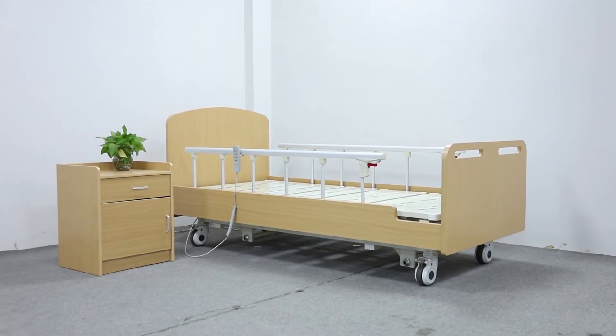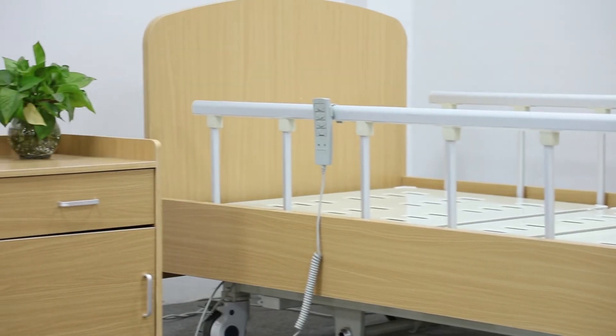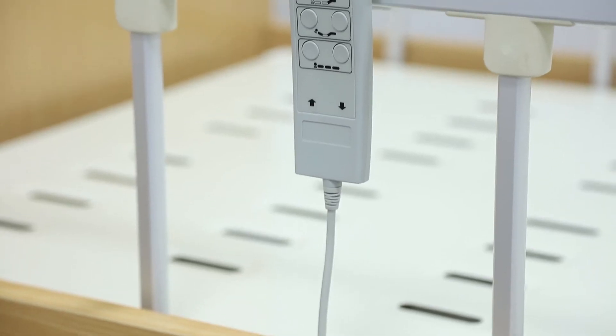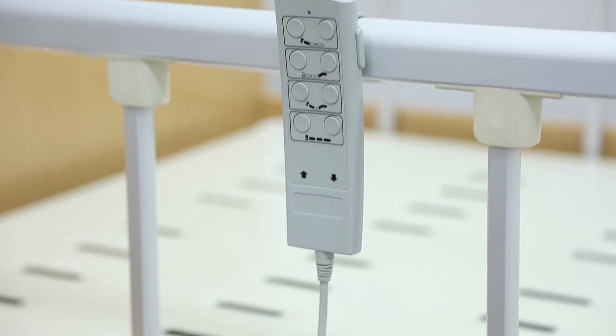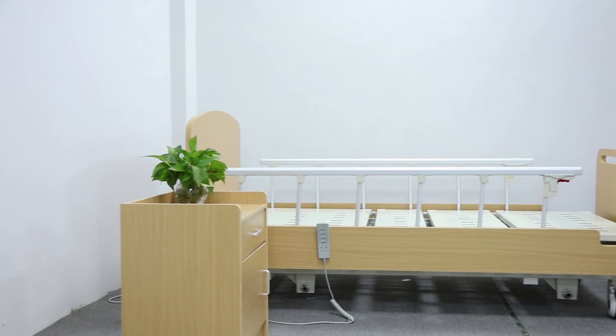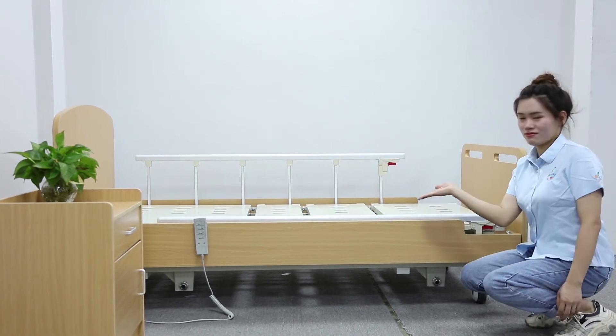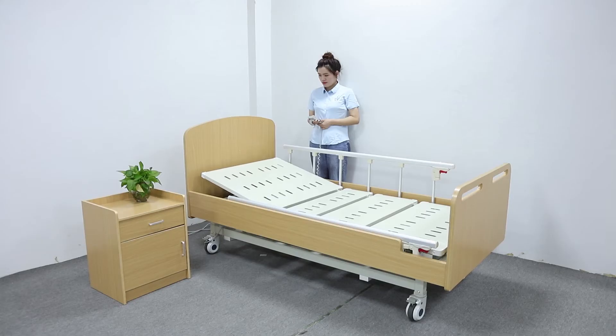Three-function home care beds. These beds are extremely cost-effective, especially in comparison to the average cost of a full electric bed. Interchangeable end boards offer more versatility for each user's needs. The lightweight design makes it easier to move around a home or facility.